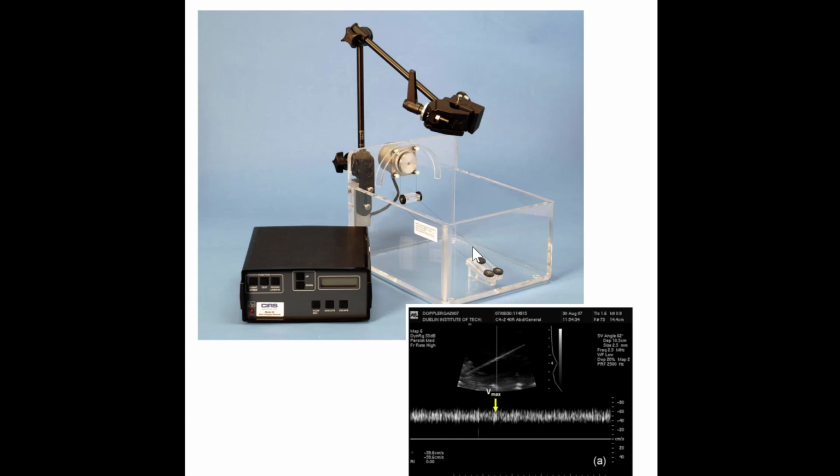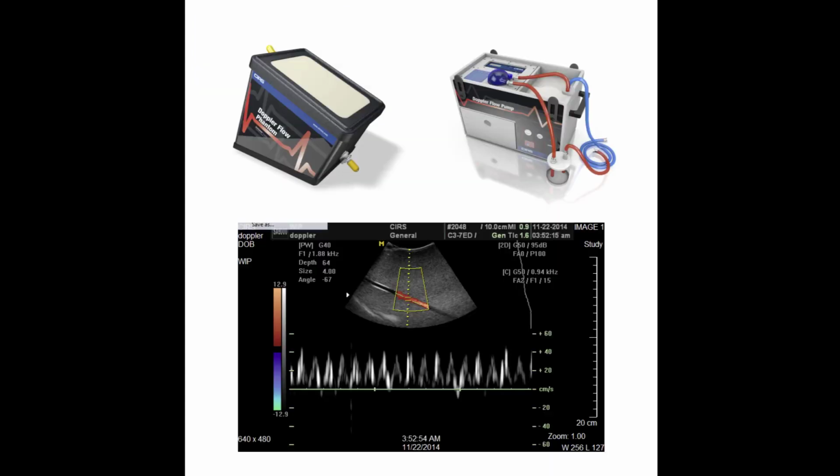The moving belt model would actually look very similar. I believe that the belt is just a little bit thicker, and we have just a few more gears that are rotating the belt through in a very similar fashion. The pump model then would look something like this. We have basically a soft tissue mimicking model, and then through the middle of it is a vessel. We have little knobs on either side that the pump can be hooked up to. So a pump is needed for this.